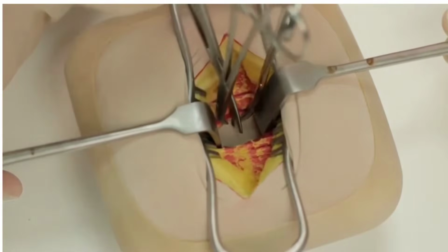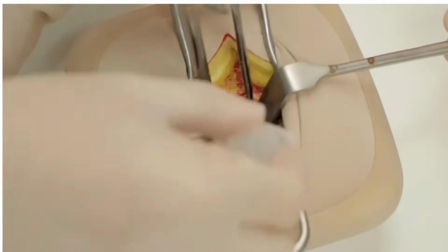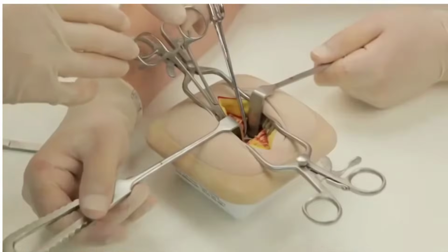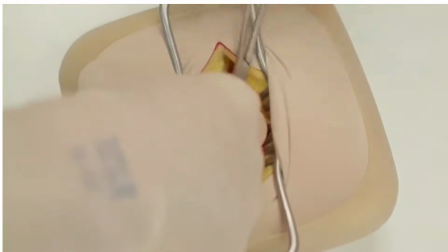Locate the cecum and follow the taenia coli to identify the appendix. Gently deliver the appendix into the wound. Place a moist pack around the operative field to minimize contamination.